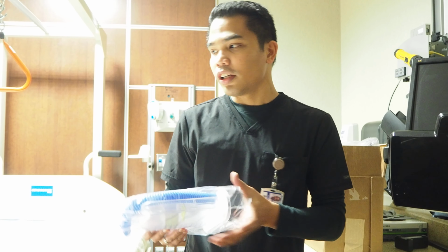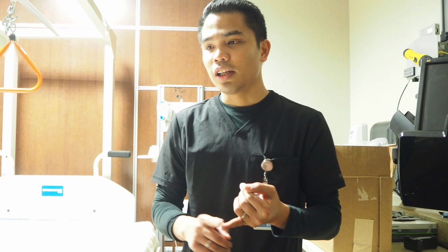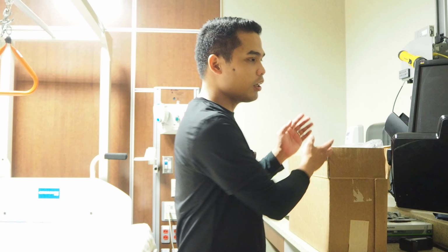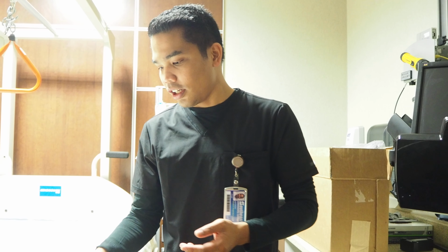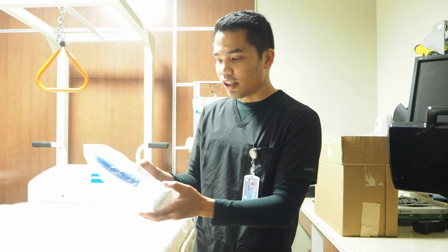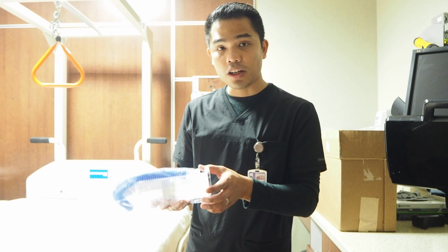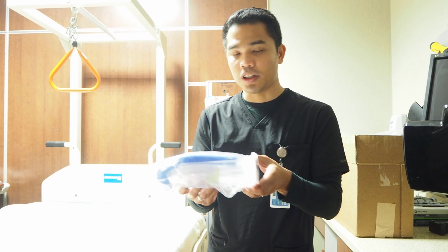So after that, we always make sure we assess the patient, and one of the things that's very important during assessment is we always auscultate, and we also have to check the ID band to ensure they are the correct patient. And then once you're done, we wash our hands and then we proceed with the therapy. When doing this therapy, we always make sure that we inspect the device, especially if there are any cracks present in here. And every time we do this, make sure we demonstrate in front of the patient so that they fully understand how to properly do this.